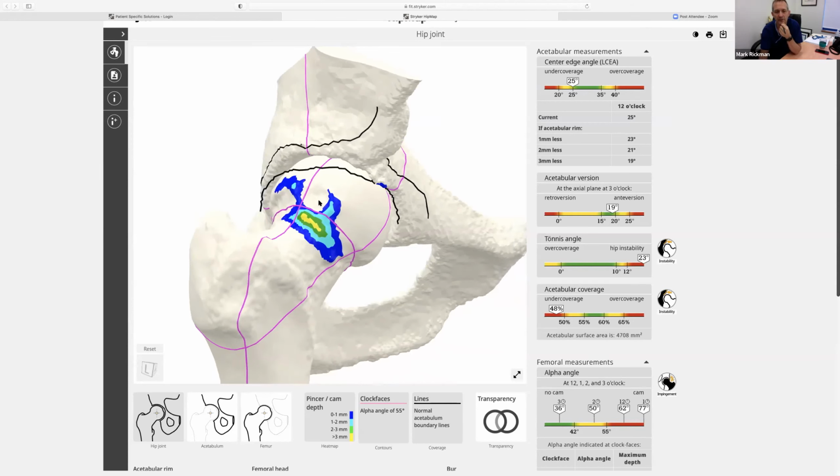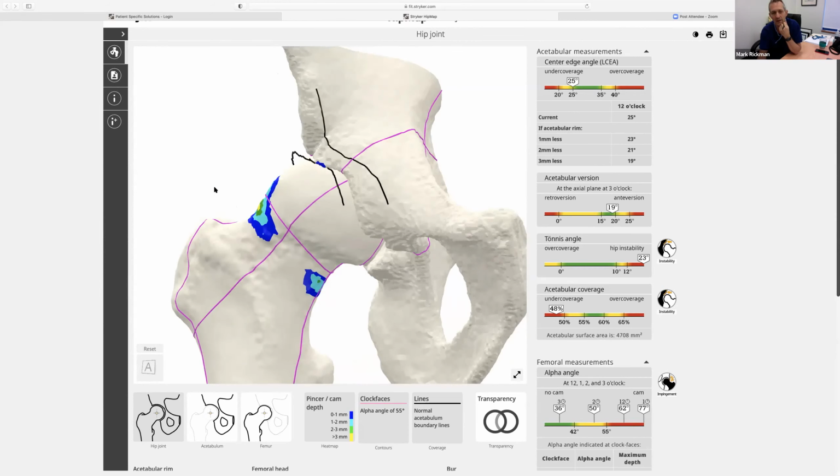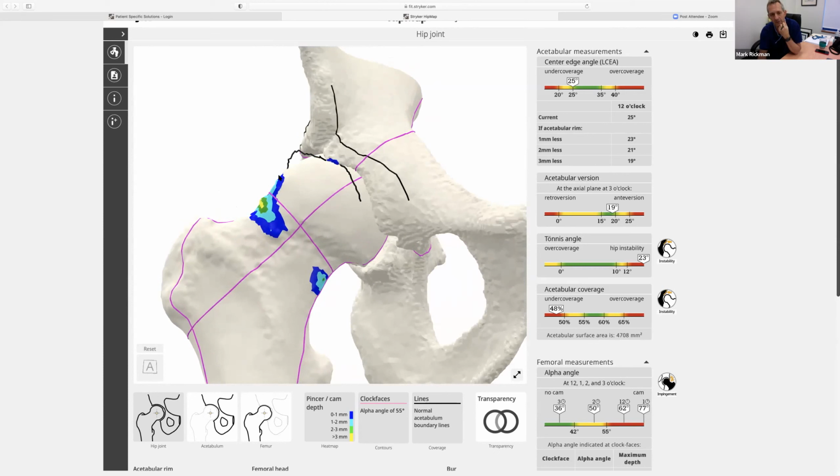And it's really interesting that you can see where they've resected his cam. And you can see the area that they've taken bone away, which is possibly from maybe here to here. And that's the deepest bit. But they haven't taken away anything here slightly further down the neck. And when you spin him round, you can see that they've sort of done that and missed this bit. Now, that's really easy to do.